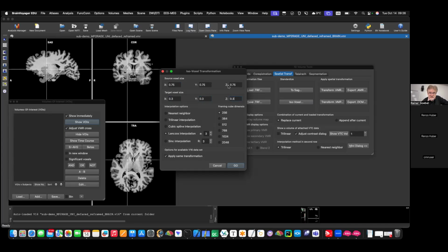And I start to like this resolution. Normally, I recommend 0.5. And I know Laney wants 0.1 to 0.3 or something. So I'm at the edge for Laney, but it's still okay, I think, 0.3. Seems to work, at least I tried. And then we go to this space, 512, and the rest we can just keep.